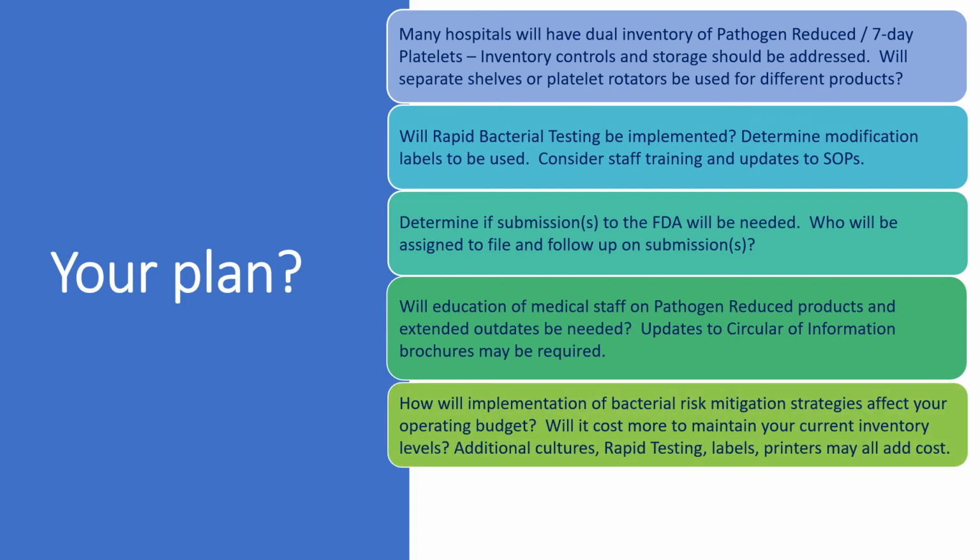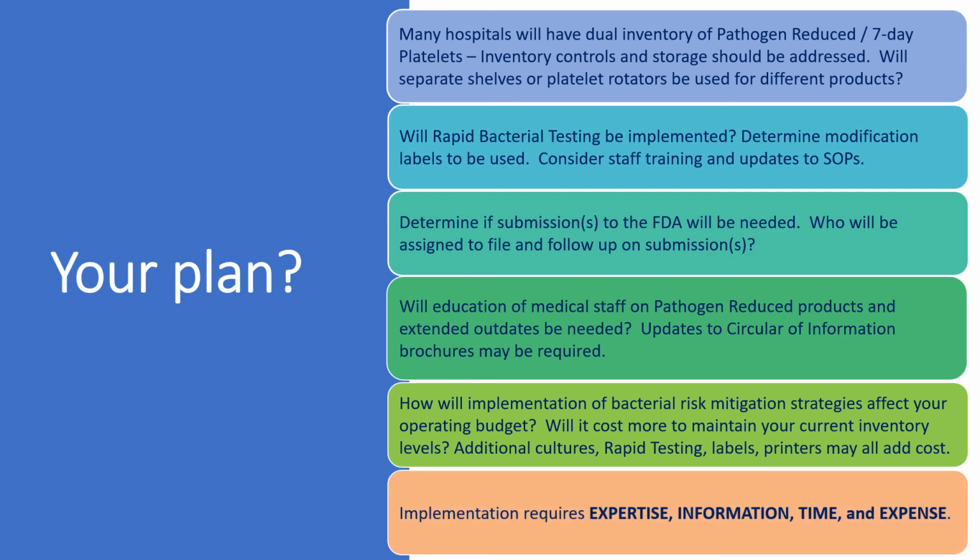How will implementation of bacterial risk mitigation strategies affect your operating budget? Will it cost more to maintain your current inventory levels? Additional cultures, rapid testing, labels, printers may all add cost. Implementation requires expertise, information, time, and expense.